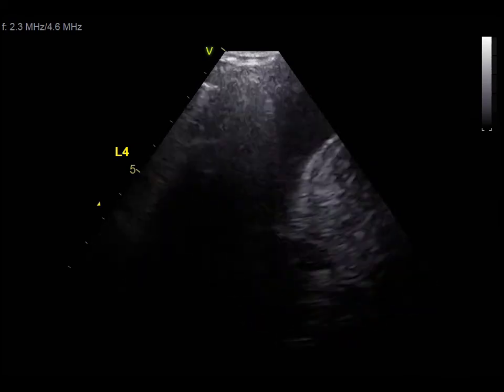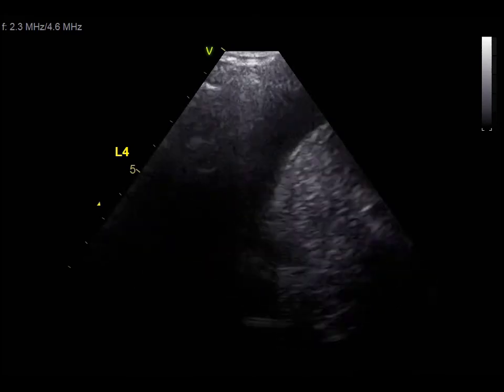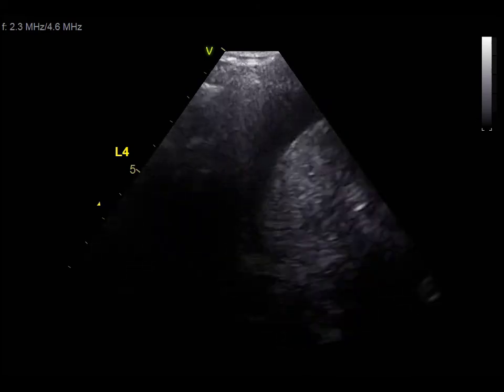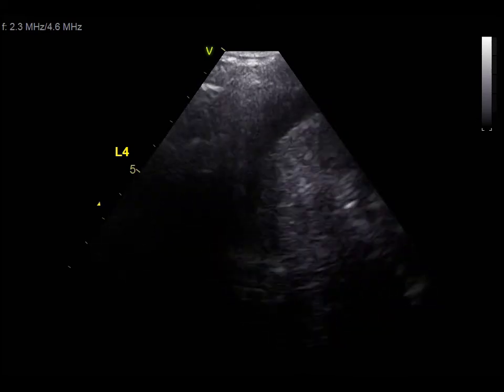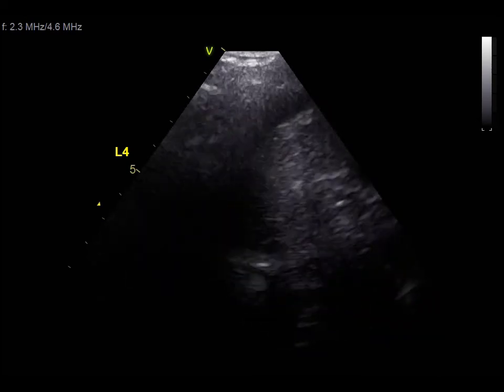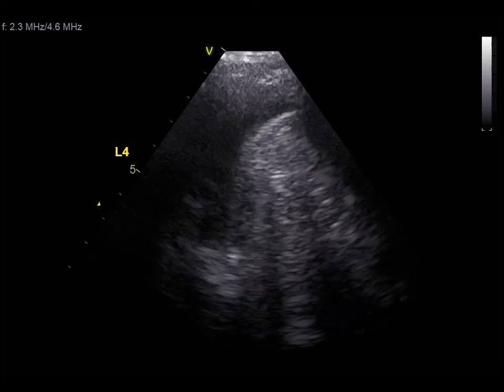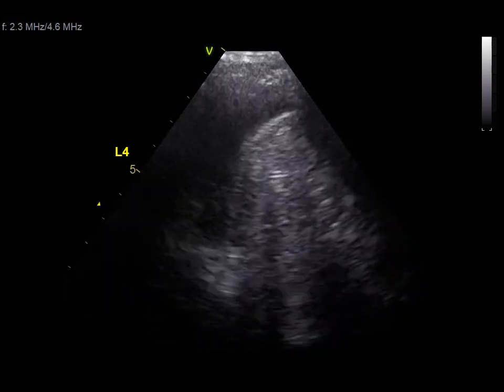And that's L4. Spleen, a pleural effusion. See how that big black area is quite a large pleural effusion on the left, and that's the lung coming in with a couple of B lines over there. Same here, B lines coming through the pleural effusion and some collapsed lung more posteriorly, so that's a bit of collapse, like a compression atelectasis from the fluid.